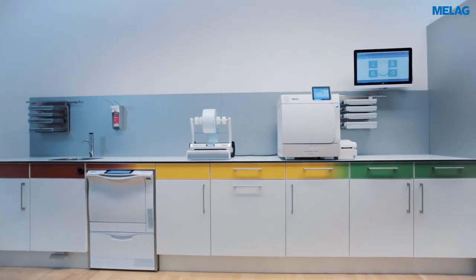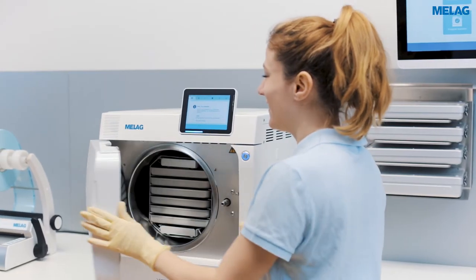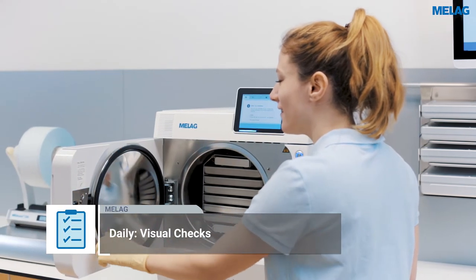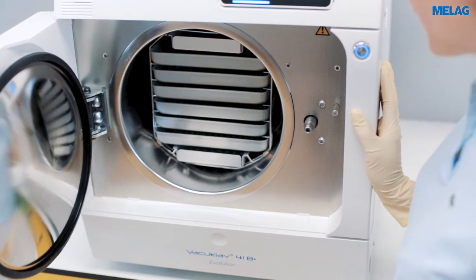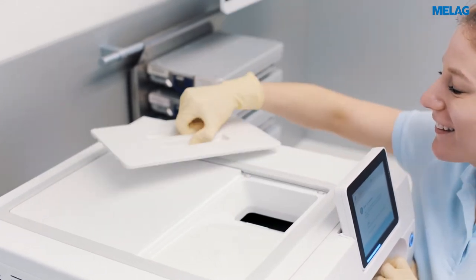Please comply with the manufacturer's recommendations regarding routine checks of a steam steriliser and document the results. Besides the visual check of the door seal and door lock, the operating agents and documentation media should be checked once every working day.